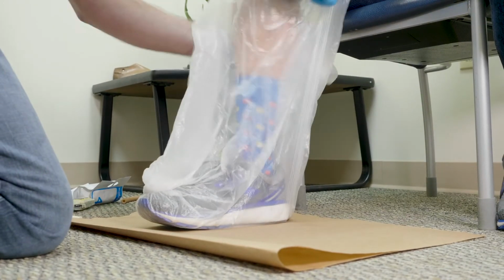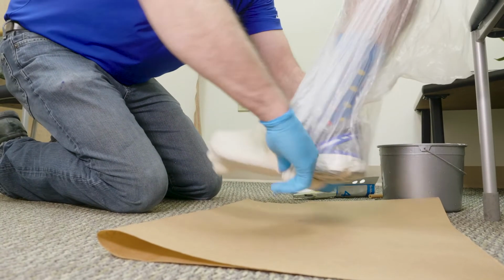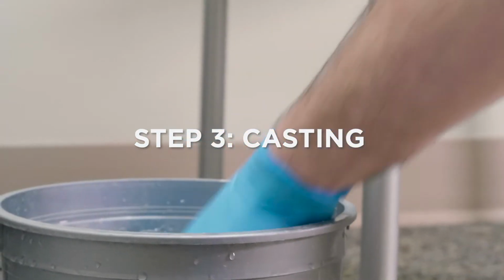Place the plastic bag over the shoe. In order to keep the bag stationary, roll the bias stockinette over the plastic up the length of your patient's calf. Now, on to casting.